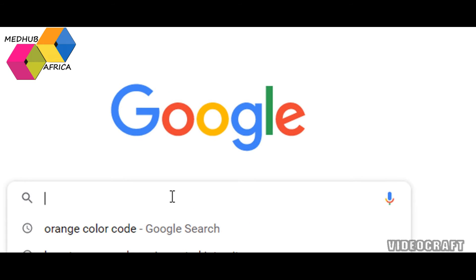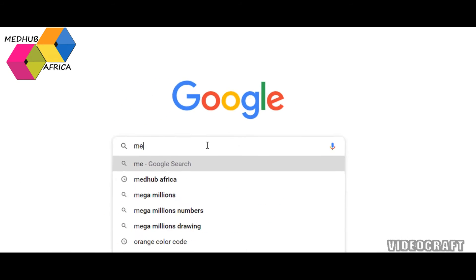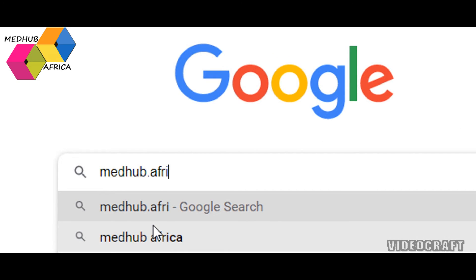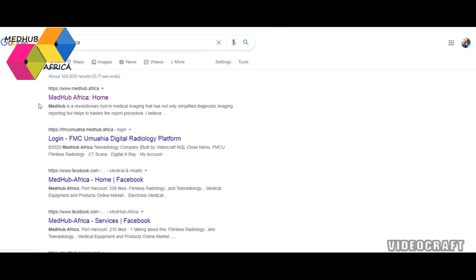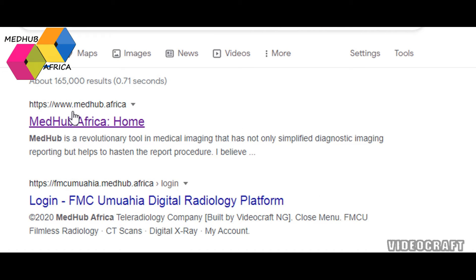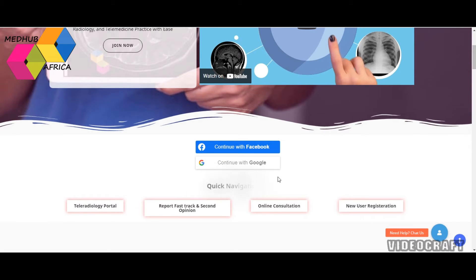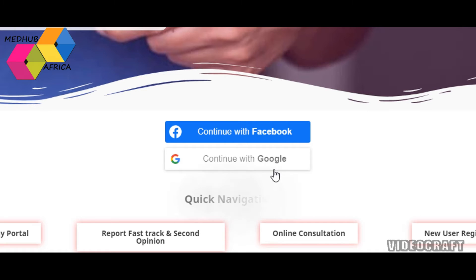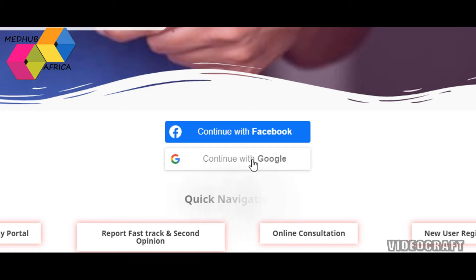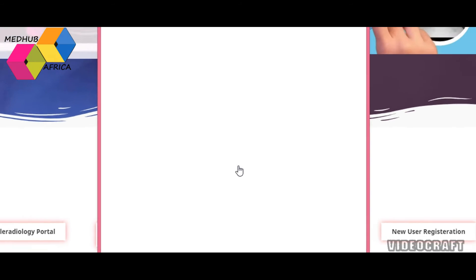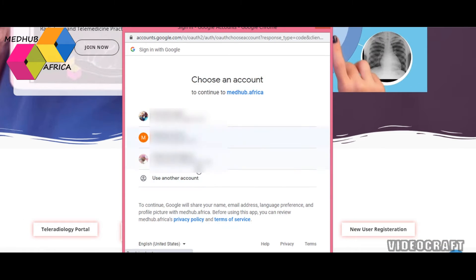Go to your browser and type in medhub.africa. Once it appears, select medhub.africa from the options — look for medhub.africa home at www.medhub.africa. On the front page that opens, scroll down a bit and you will see two options: continue with Facebook or continue with Google. To use MedHub, you need to log in or sign up. You can sign up with Google or Facebook. Select one of your Google accounts to sign in.